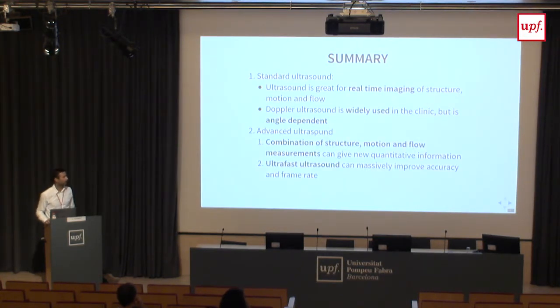Advanced ultrasound, particularly ultrafast ultrasound, and the combination of structure, anatomy, and flow measurements can actually unveil a new world of new measurements that we can make for clinical use or to feed models.